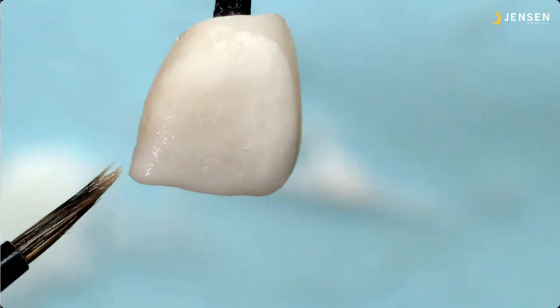So we talked about consistent control of MiYO color and structure. I don't want to talk too long. I just want you to be happy that you saw this. And now you know you can control your structure with water. You can apply it with a spatula. You can apply it with a brush. It manipulates a lot like a porcelain that has a lot of glaze liquid in it.